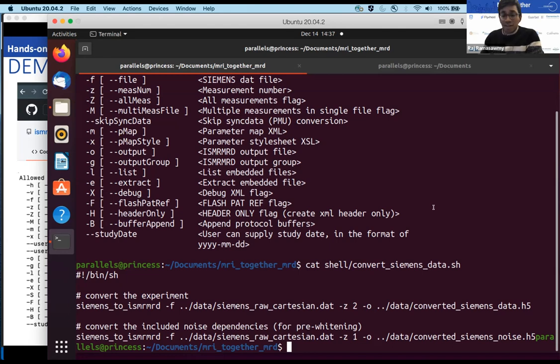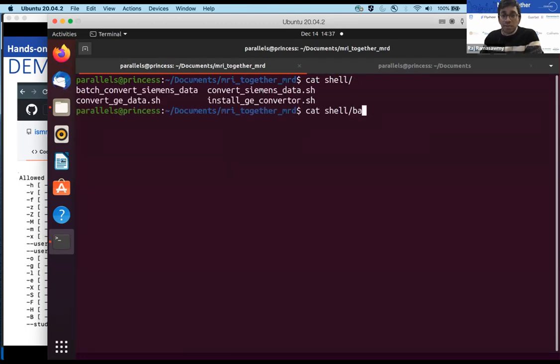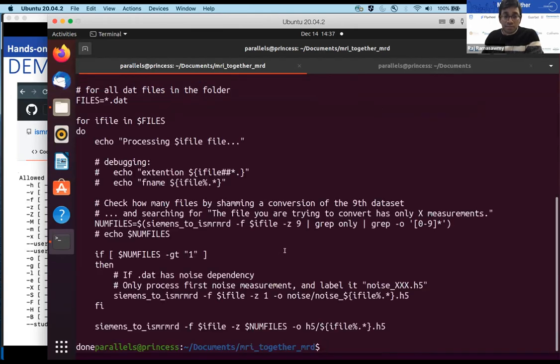I actually also have a script here. If I just, in the shell, what have I got now? So this example shows how I do this for a script base. Depending on how many data sets, or what kind of data sets I have, that number could vary. And so I actually do this cheat where I stick in a very large number, and that will return you the number of files in there. That's one way of doing it.